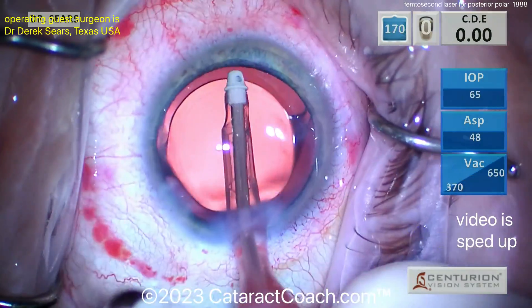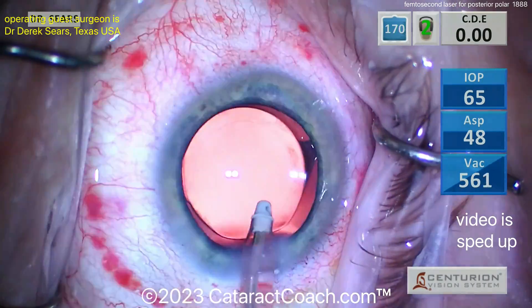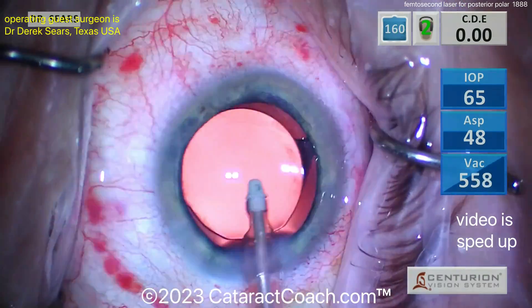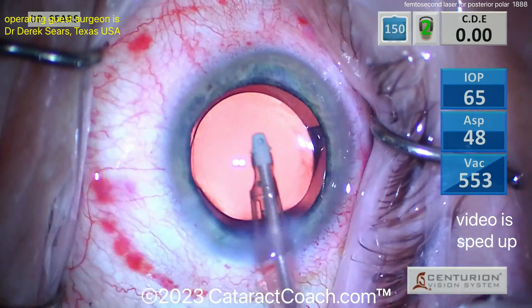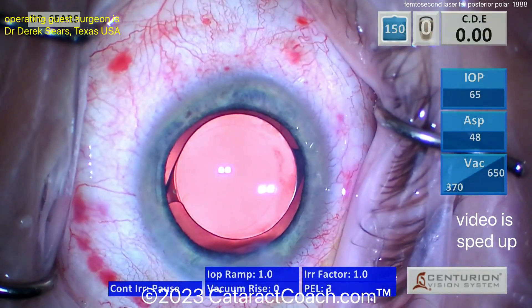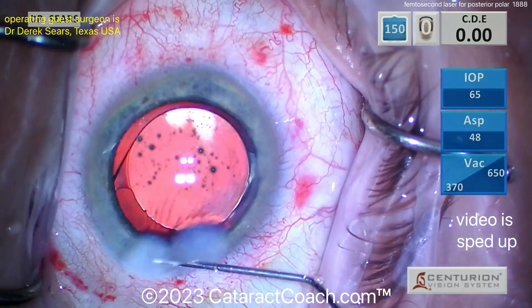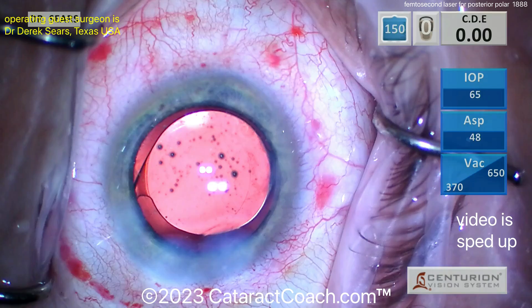We probably have 40 to 50 posterior polar cataract videos, and a lot of femtosecond ones too — but this is the only femto posterior polar one I have. Check out cataractcoach.com — we have a full categorization of all different types of surgeries. You can see the full list of videos and topics, click on the posterior polar category, and you'll see a lot of these videos. If you've got a posterior polar case coming up, you owe it to yourself and your patient to watch those videos and learn the techniques.